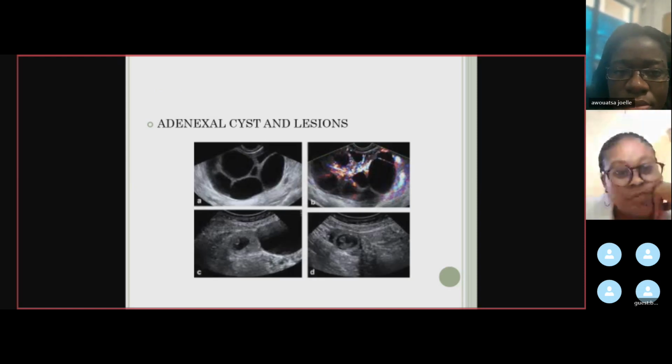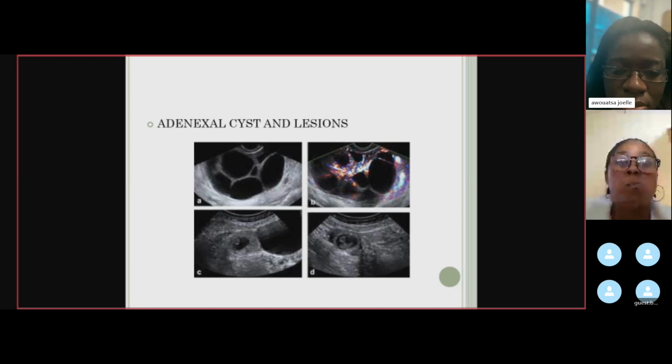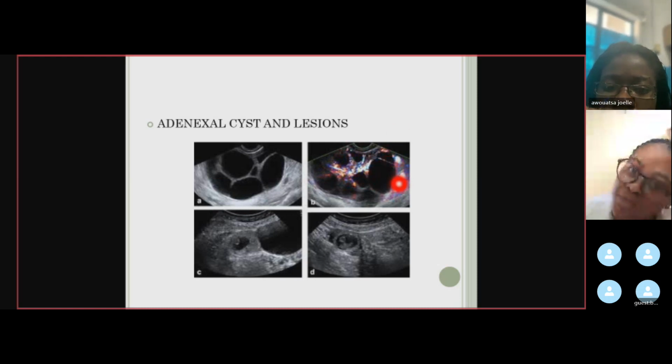See, here also, this is adnexa. In the ovaries, you can see there are multiple cysts and lesions present. The above one shows the cyst. They are circular in structure and filled with fluid. The fluid can be filled with debris also, some moving structures; otherwise, it is clear. So this picture shows the cyst. There are multiple cysts, and this is a Doppler image with color.